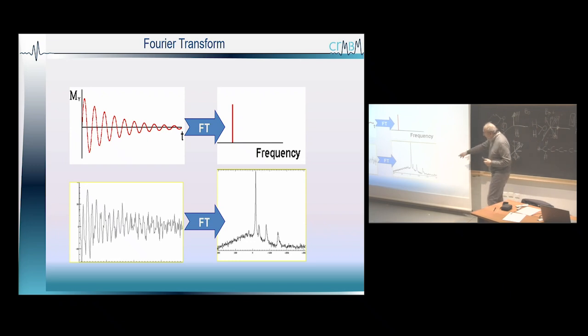And in this spectrum, you can see that you have three different frequencies for each phosphorus in here, because the electronic environment is different, so spectroscopy is able to distinguish this one from this one.